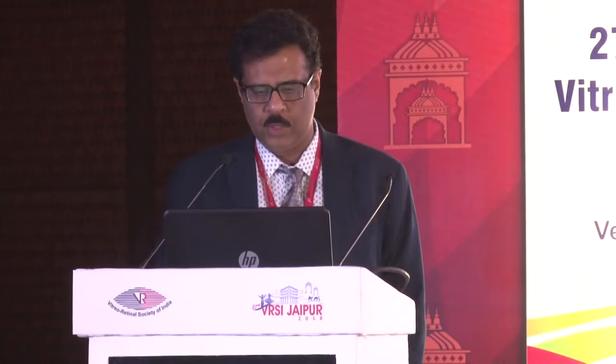Good morning everybody. My topic is tips and tricks of intraocular foreign body removal. Troubles in managing cases with retained intraocular foreign bodies are diagnostic dilemma, problems in localization, associated intraocular damage, explaining the prognosis, and difficulty in management.